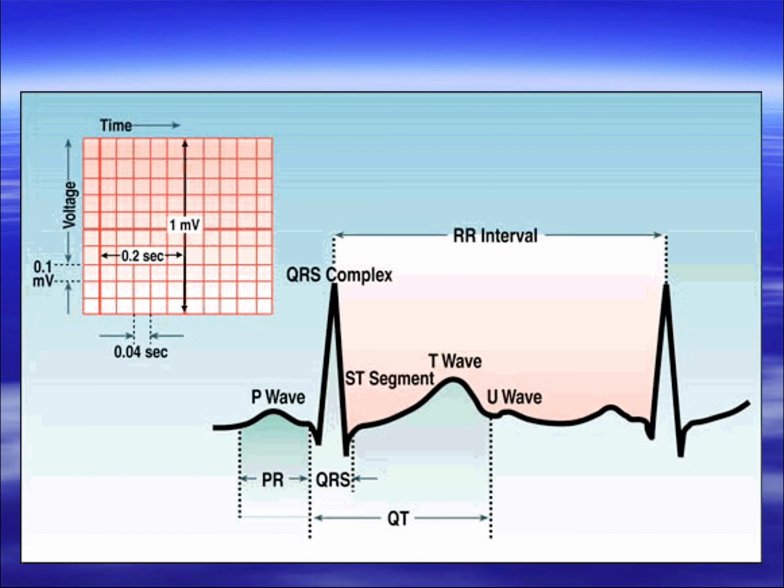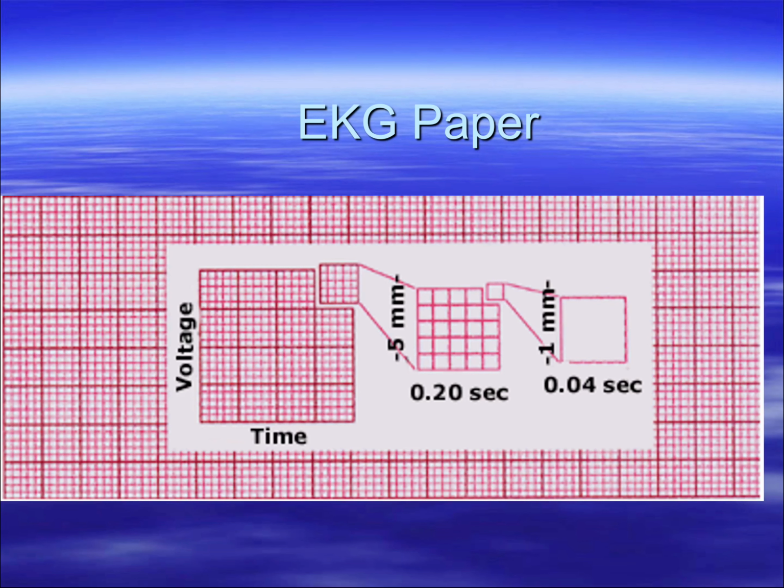The T wave in lead 2 is pyramid-shaped and upright and should be spiked like a pyramid, but it can be rounded. We'll talk about morphology of T waves a little later. The R to R is just the distance or time between one R wave to the next, but ultimately gives us our heartbeat, our pulse, and we'll talk about counting beats in our next class.